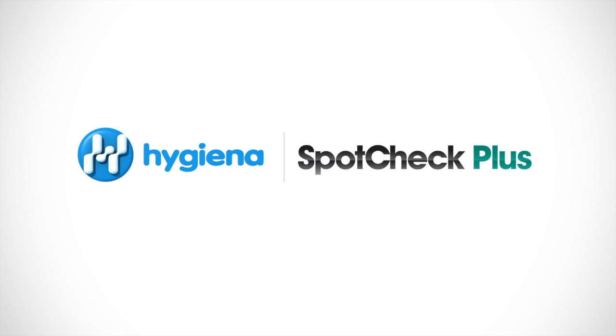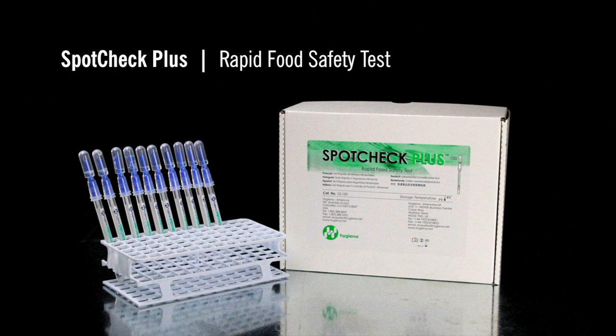This instructional video demonstrates the proper use of SpotCheck Plus, Hygiena's Food Safety Residue Test. SpotCheck Plus detects the presence of glucose and lactose on a surface as an indication of surface hygiene.